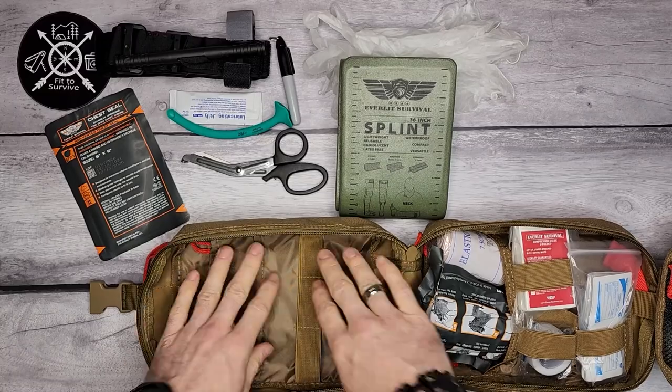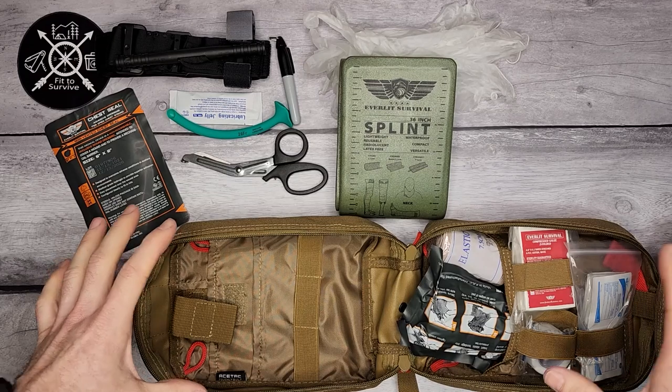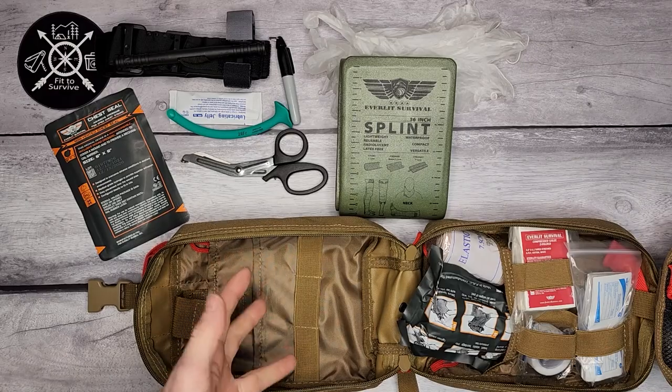That's everything for the front compartment. I wouldn't say this pack is completely filled out — there's still plenty of space to add some extra things you might need.